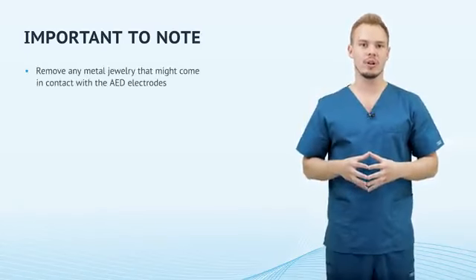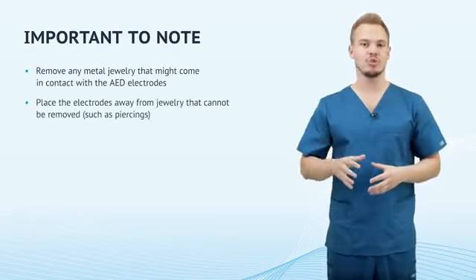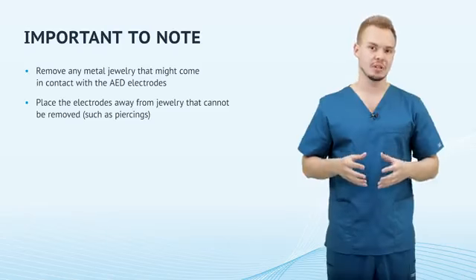Remove any metal jewelry that might come in contact with the AED electrodes. Place the electrodes away from jewelry that cannot be removed, such as piercings.